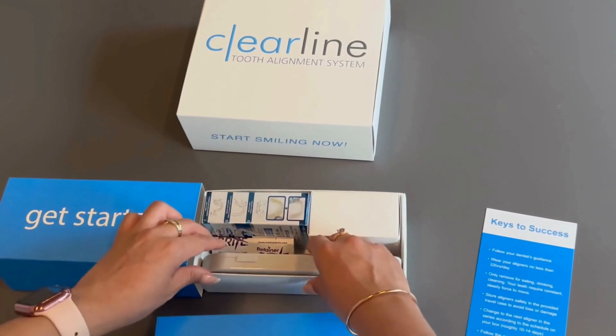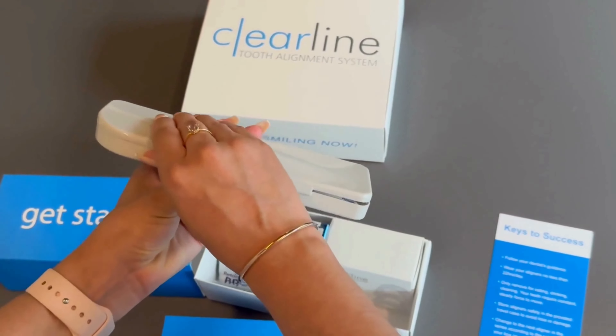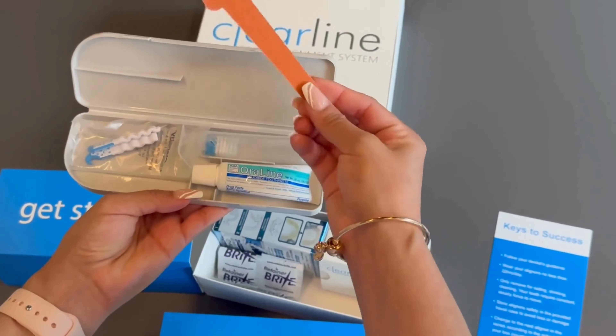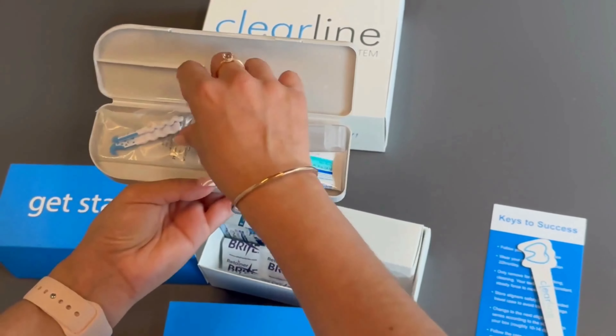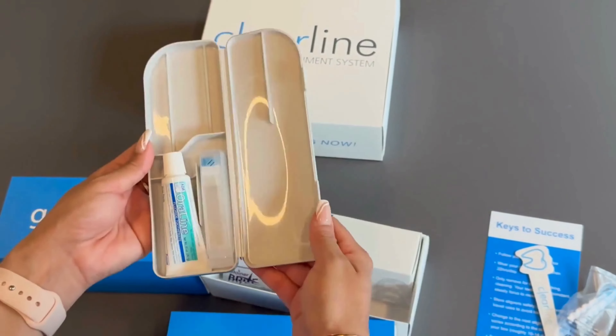The first thing you will find in the Get Started box is our Clearline Travel Case. It contains a toothbrush and toothpaste, as well as a file for smoothing any rough aligner edges, and the clenchy tool for both seating and removing aligners.